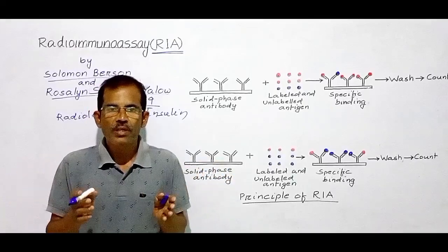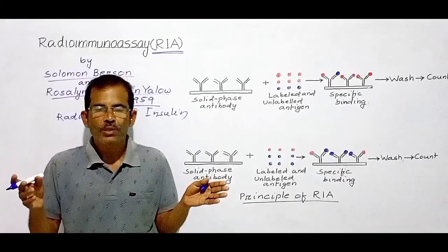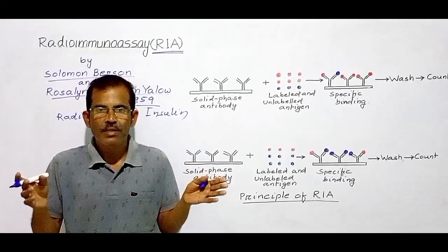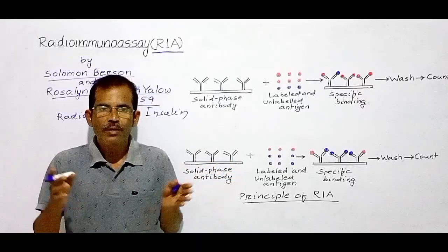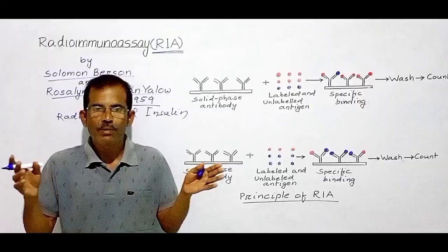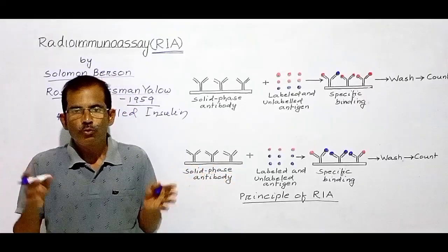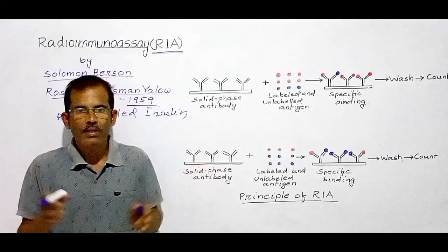Radioimmunoassay is a competitive immunoassay in which there is a competition between radiolabeled antigen and unlabeled antigen for binding with a limited amount of specific antibody. It involves the formation of an antigen-antibody complex.